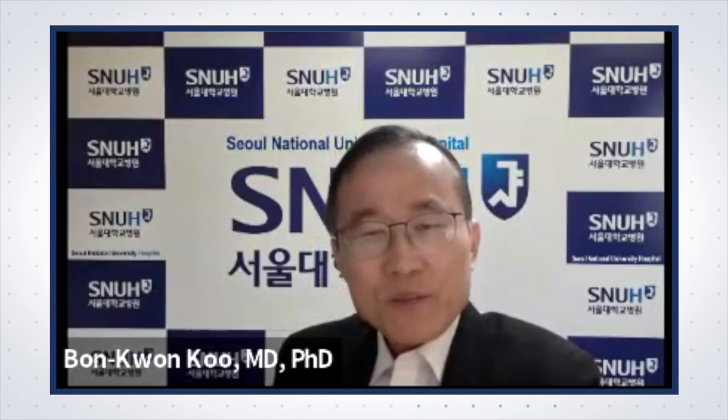If it is 1 year, I will definitely send the patient to the cath lab to do a PCI. But if 3 years, I'll intensify the medical treatment and we'll do a follow-up CT scan 2 years later. And the second element is which component is a key contributor for this patient's event. For example, if this is a heavily calcified burden plaque, that's for revascularization. But if it's a highly vulnerable plaque, which can be reversible, such as a zero calcium score on that plaque, which means that if I make the LDL less than 30, the plaque will be reversed in 2 or 3 years.